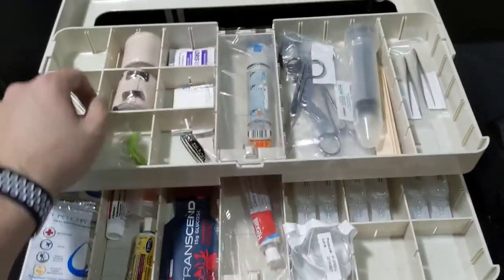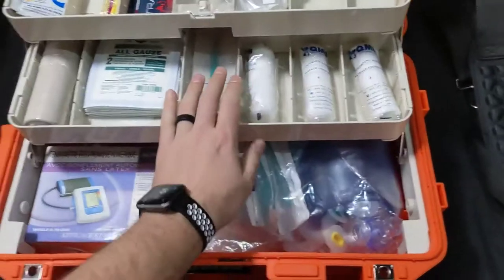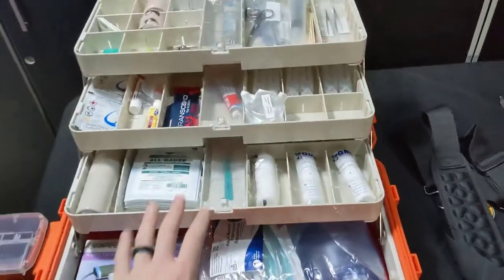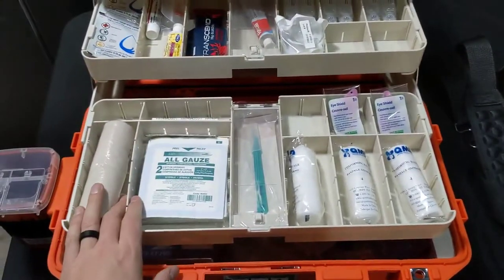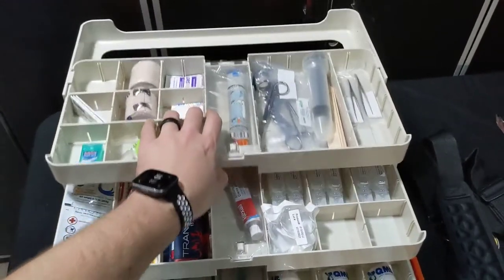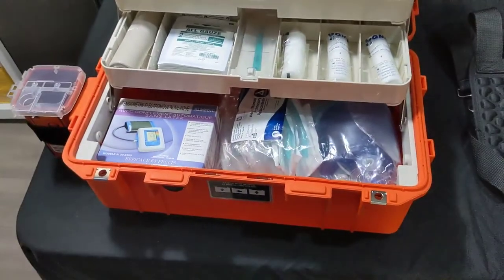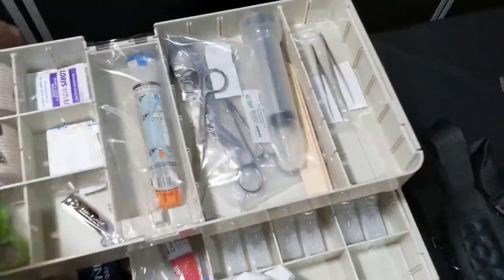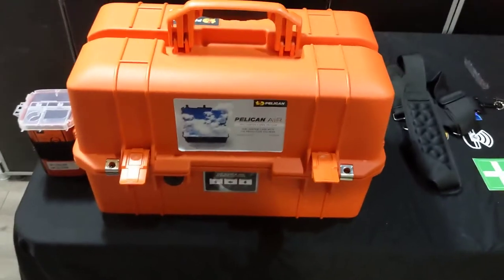Just showing the different ways you can modularize these trays and change around the system — everything moves. This is a great setup for a mobile aid station: a summer camp, a remote work site, expeditions, event medical, first responder, paramedic, EMS — it's just a great system. It's going to last forever, it won't break easily, and it's backed by Pelican's warranty with great utility. That is the 1465 Pelican Air, now available at wildmedkits.ca.